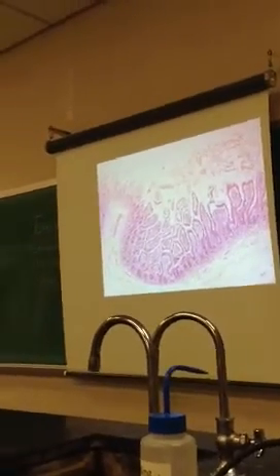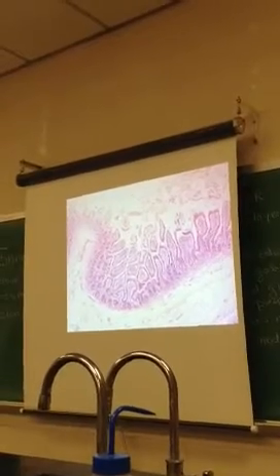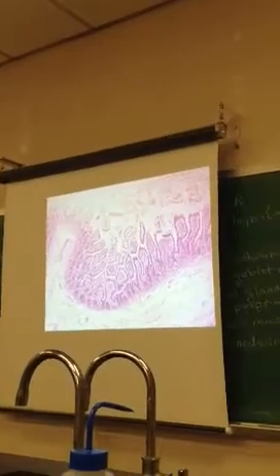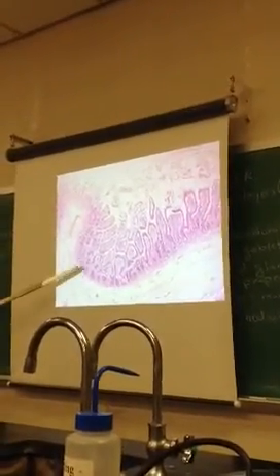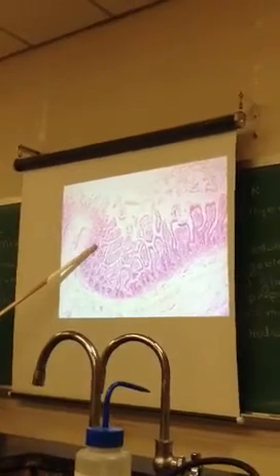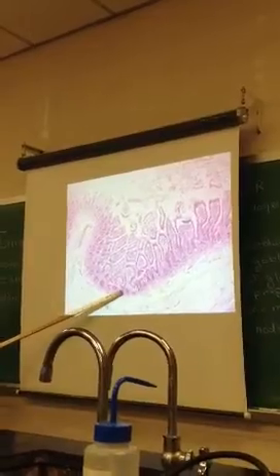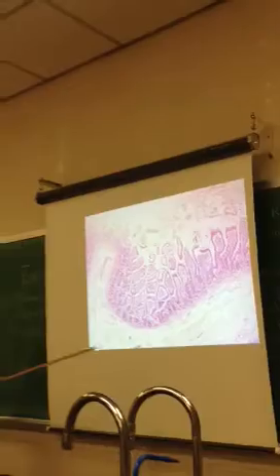Here's the mucosa layer, and again we have simple columnar. We've got a little bit of goblet cells that I'll increase that magnification for, but those also go around the villi, or the villus. And then lamina propria would be everything that's all underneath here, spread out through. And then these are going to be our intestinal glands, sometimes called the crypts of Lieberkuhn, but these are all the intestinal glands. So just like gastric glands are in the stomach, these are intestinal glands because we're in the intestine. So they get a name change.